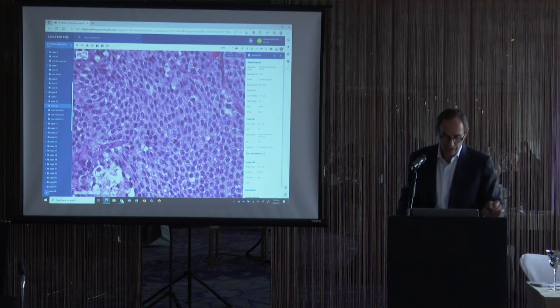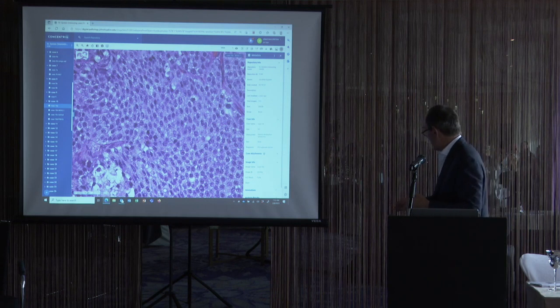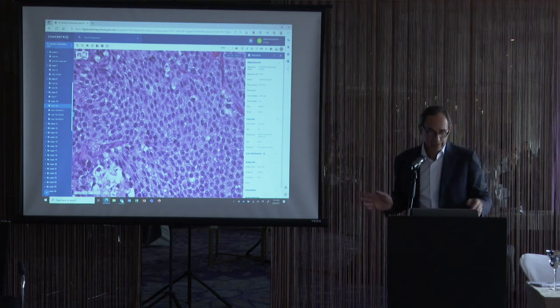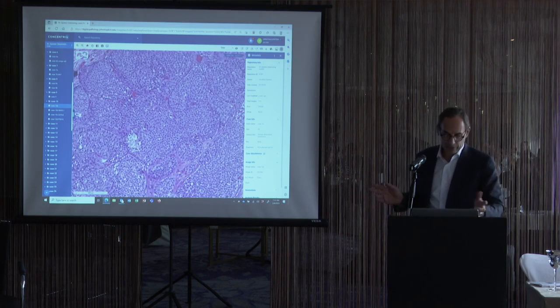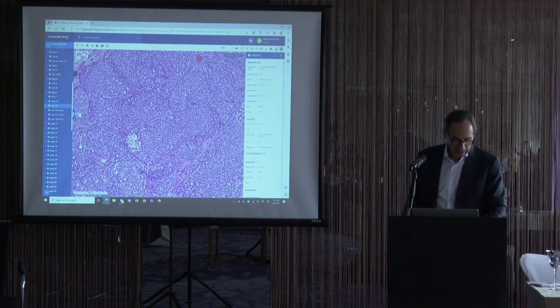Prostate cancer, when it's high grade, still most of the time has cells that look relatively uniform, with nice prominent nucleoli. This doesn't look like urothelial cancer; this looks like prostate cancer. If this were my own case, I probably wouldn't have done any stains, but this was stained at an outside institution, and they stained it for NKX3.1.